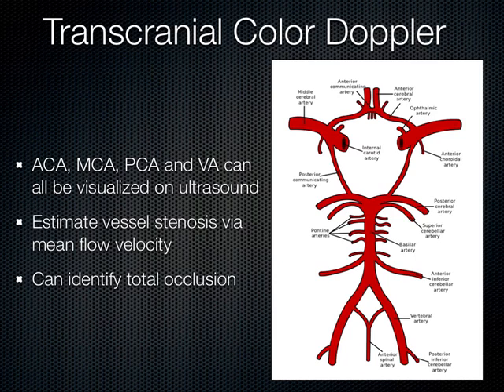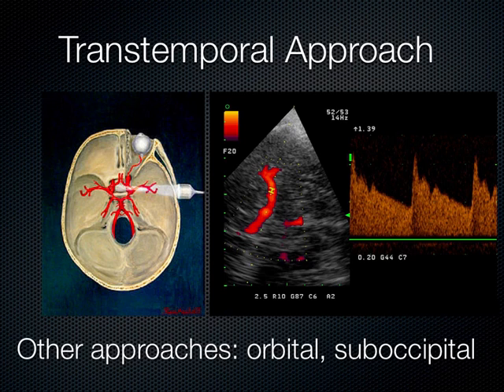Using smaller doses of TPA, because it has a lot of side effects, and then when the TPA arrives at the location of the clot, you can activate the TPA or potentiate its effects using ultrasound to help increase the surface area of the clot for the TPA to work on. Anyways, a lot of cool stuff going on here. It probably has a lot to do with the future of neurology and neurosonology, but we're just going to talk very briefly about what it looks like on ultrasound.